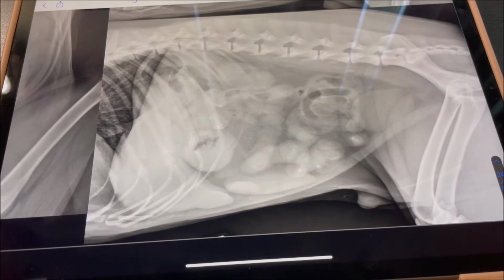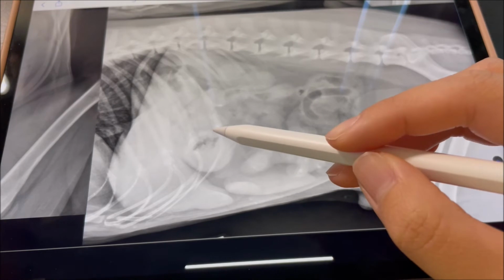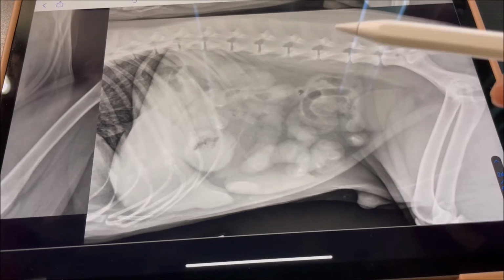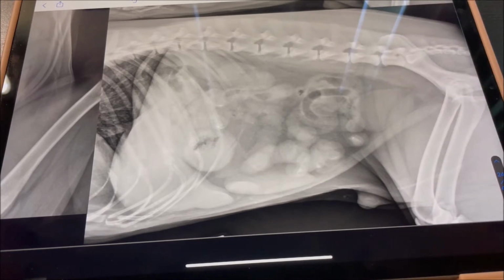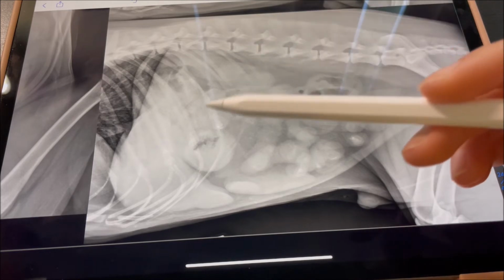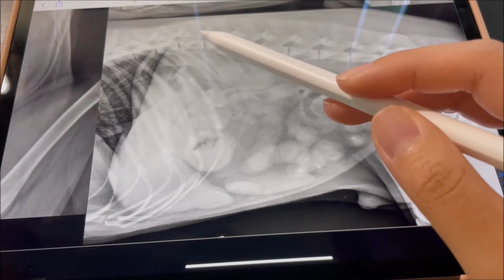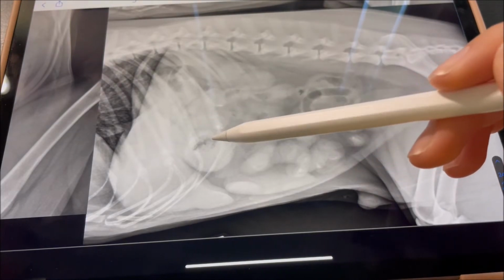So what's happening is that probably the linear foreign body has anchored itself in the pylorus, which is actually quite common, and it is sending strings down into the small bowel, and the small bowel is climbing up this string like an accordion, causing those plications. Just for review, remember that from orad to aborad, the order of the different parts of the stomach are the fundus, the body, and the pylorus.